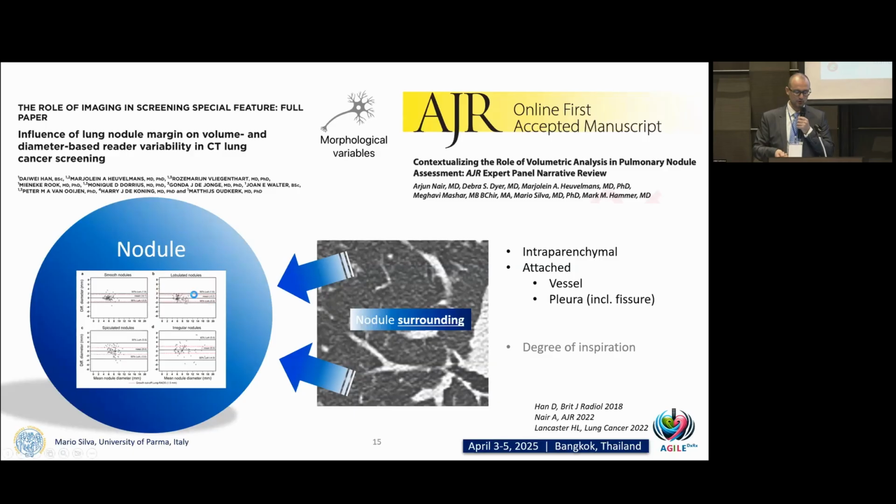Then we also have all the nodules surrounding. So we've been talking about density of the lung. So the lung density can be extremely variable. This might include emphysema. Probably this indeed helps in the segmentation of the nodule, but we can also find nodules within areas of small reticulation, ILA, the Hansa study showed us, DIP, RBILD, those are confounding factors.